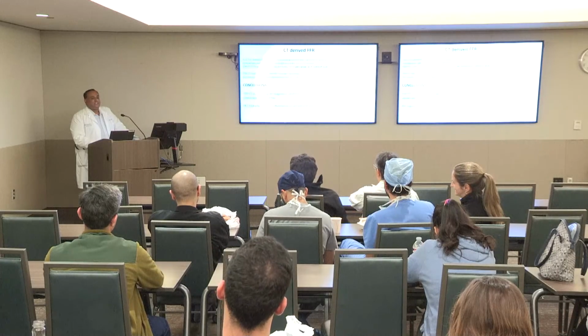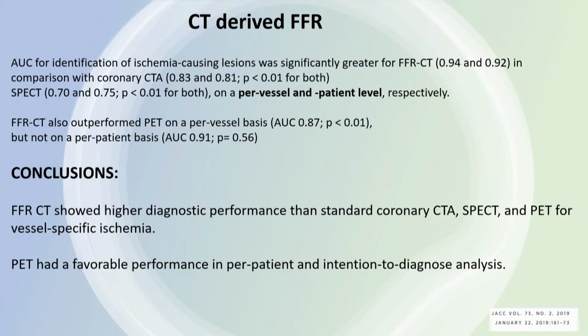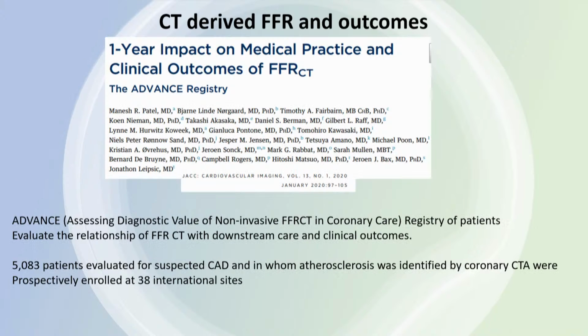It is what it is. This is a unique study because all these patients also had invasive cath with FFR measured in all 3 coronary arteries. Comparisons for invasive? Yes, compared to invasive FFR less than 0.8 as the cutoff.